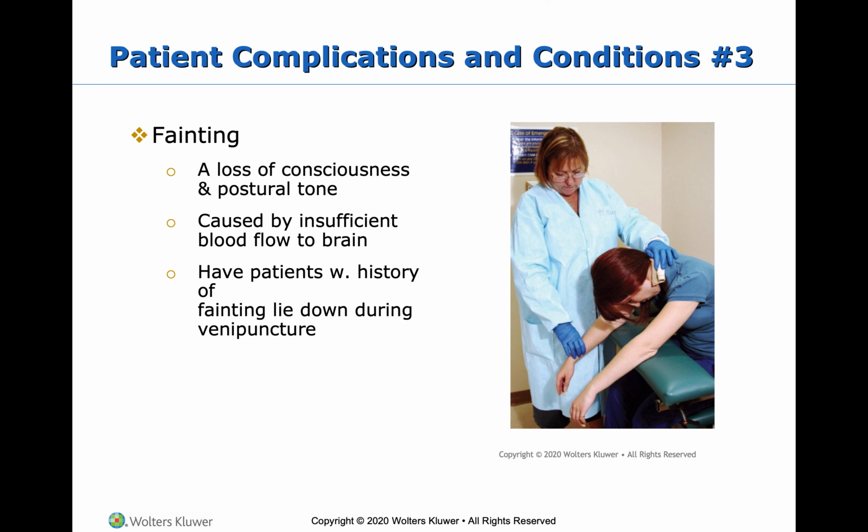We have upright draw chairs, but we also have a reclining draw chair. If a patient seems very hesitant or very nervous, or they're clammy or pale when they come in, or they tell you that they have a history of fainting during blood draws, I just immediately put them in the reclining chair, just for their safety and my own.